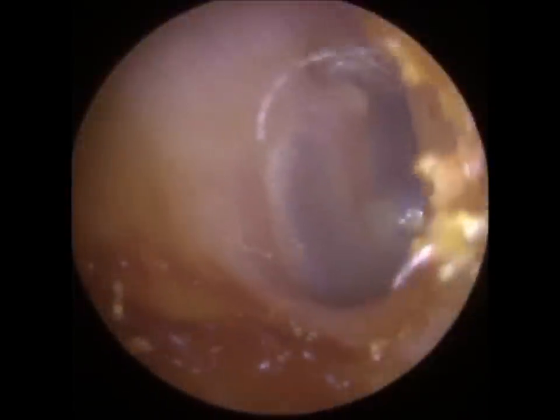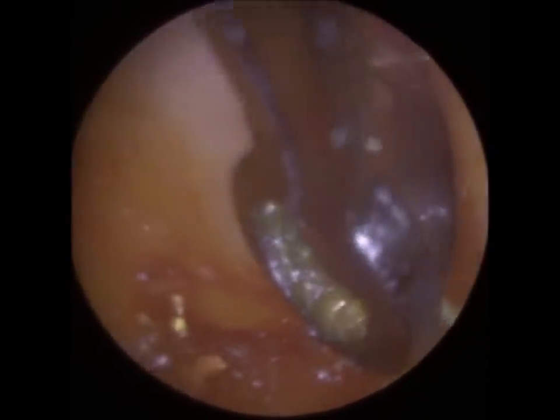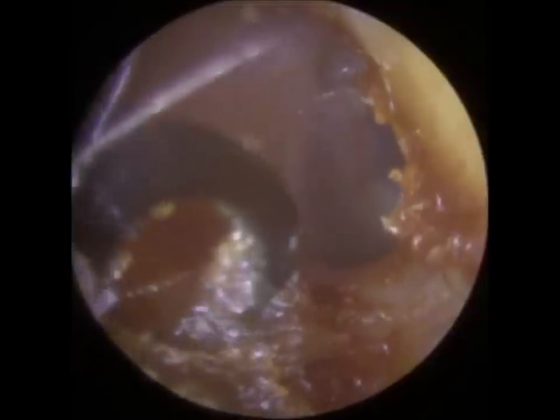It's good because we're on the outside part. I'll see if I can gently remove this — if not, I'll leave it. I'm actually literally applying no pressure, kind of holding it like a feather, so lightly I'm not applying pressure.